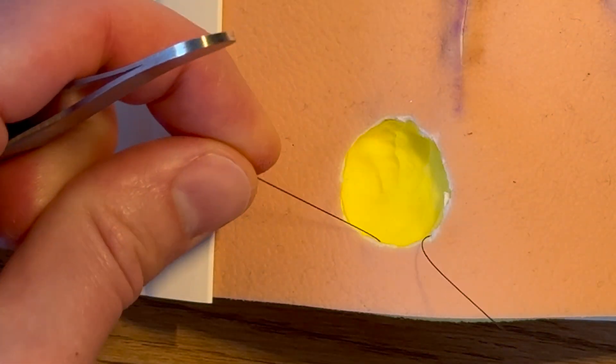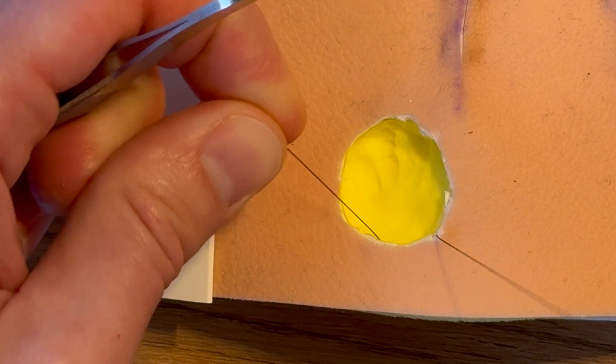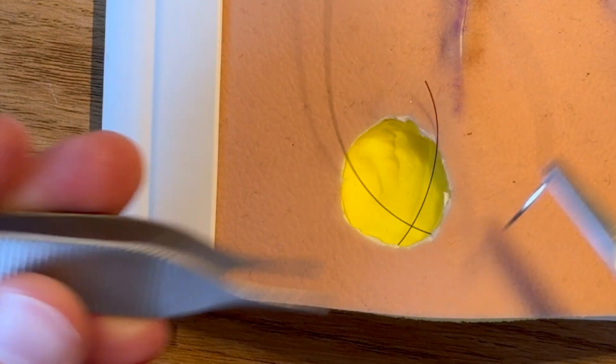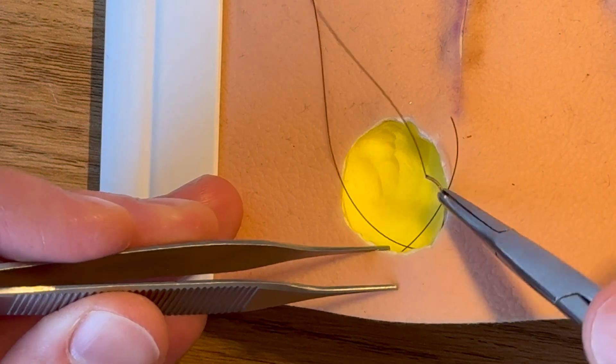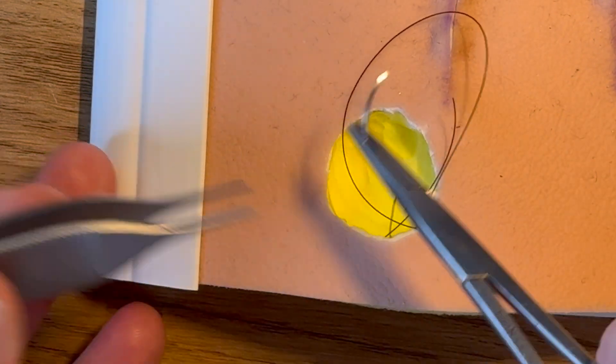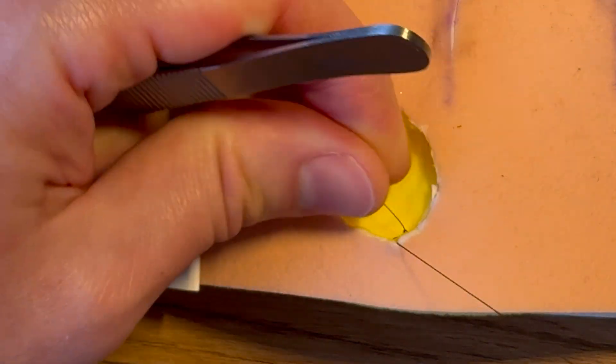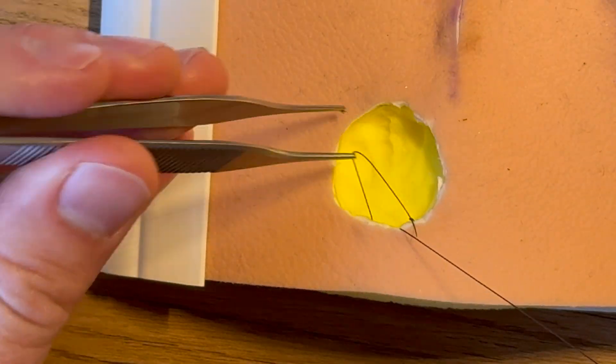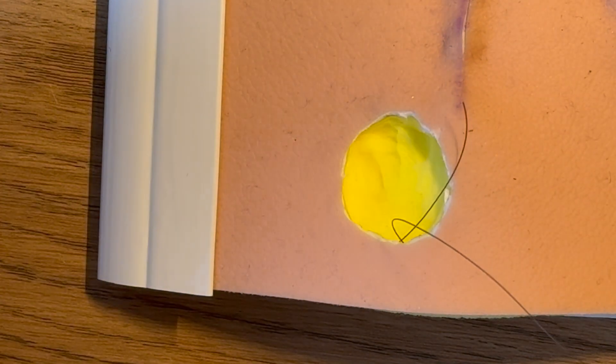Let's see how much gap we've got, so we've got a bit of a gap there which is probably okay. We could perhaps make it slightly smaller. I don't want to be right up against it. There we go, that'll do.